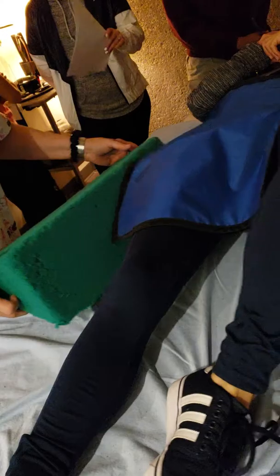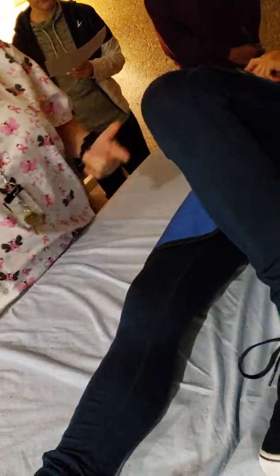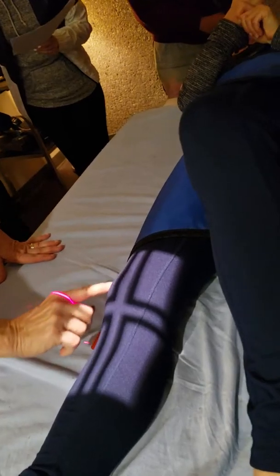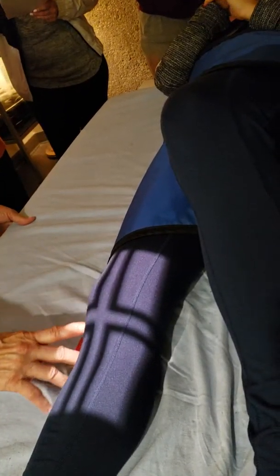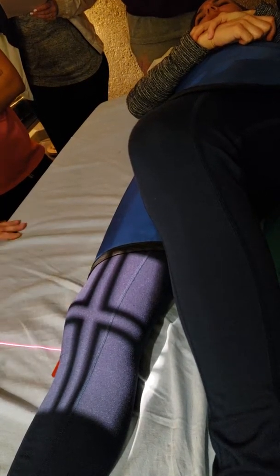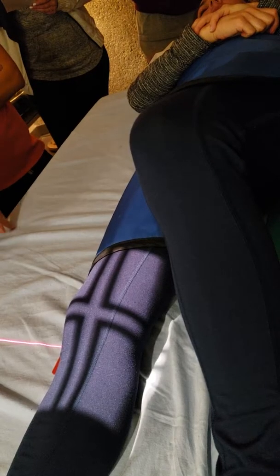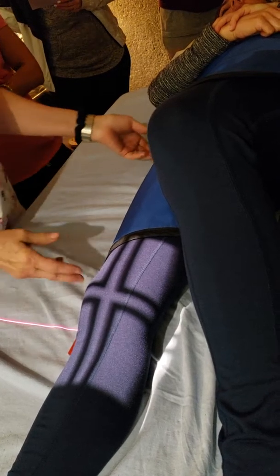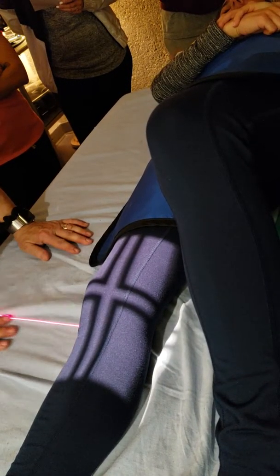Now we're going to do the lateral oblique. Go ahead and lay on your back again, now a little slightly towards me. Just for her comfort, give her a little cushion under her hip for the other leg — you don't necessarily need it for this leg, but just so they can hold their position. You can see how the patella is going to the lateral side. You're at the apex level, and then at the lateral side here. I have to go up just a little bit — patients tend to scoot up or down a little bit when moving around. Keep your marker on the lateral side. And now we have the lateral.